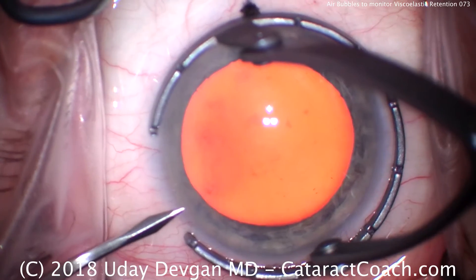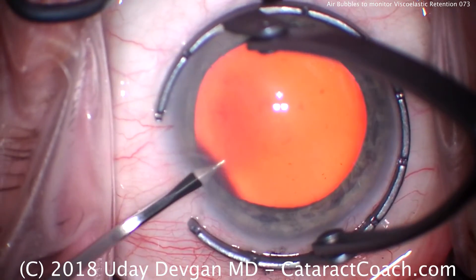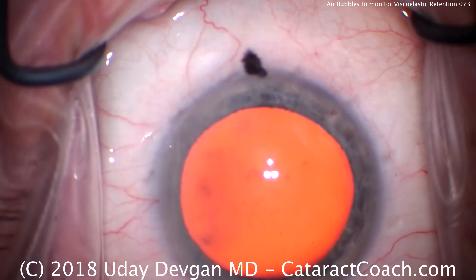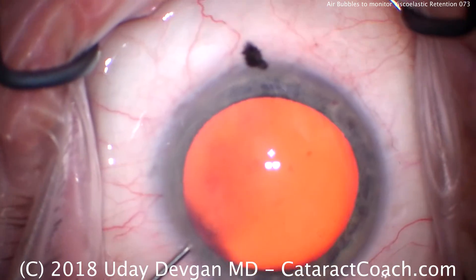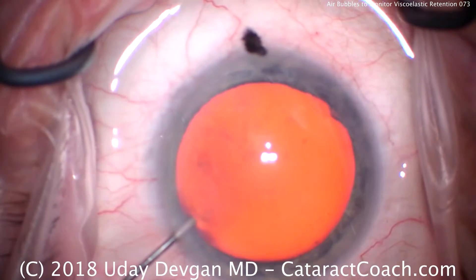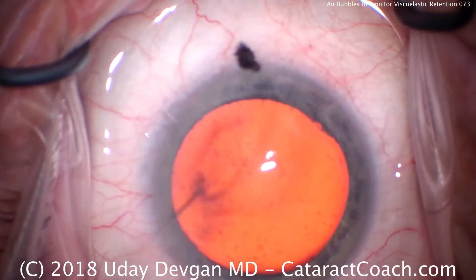Cataract coach, and we have an interesting case here. We're going to be able to monitor viscoelastic retention during the surgery. Here's how. As we instill the anesthetic in the eye, there's a little air bubble in it, so look what happens.